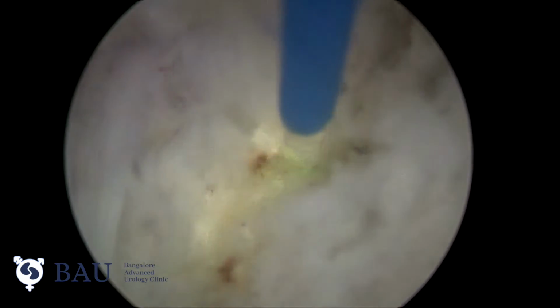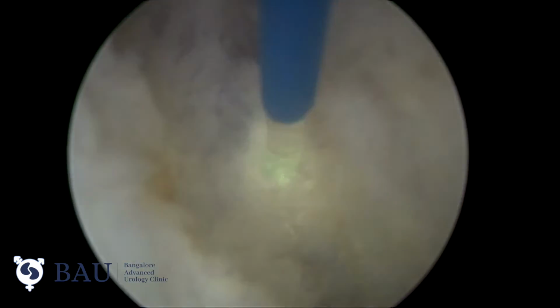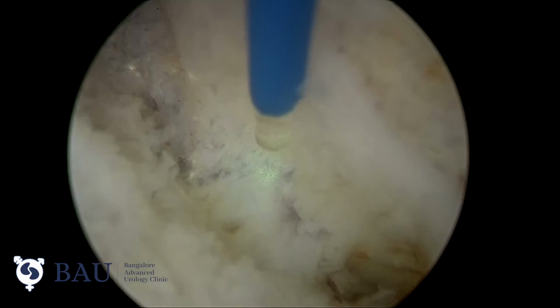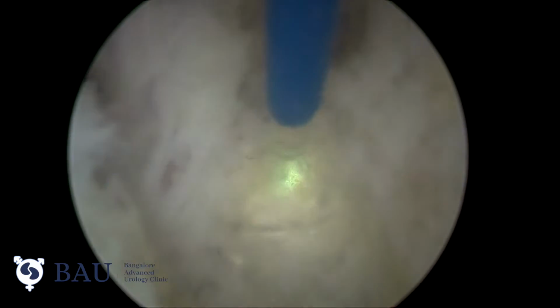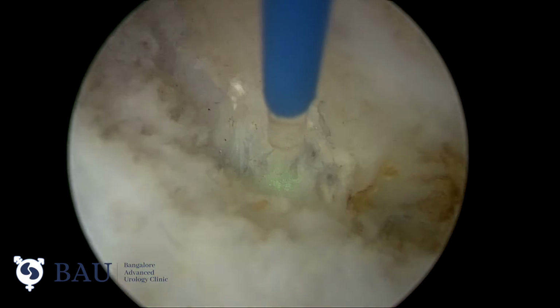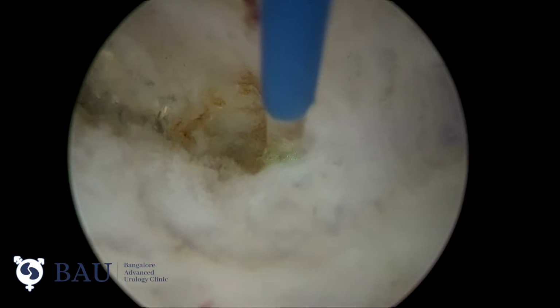In this patient, the capsule is very thin, so we have to be careful during dissection. Should never perforate the capsule and be close to the gland. You can clearly appreciate how the capsule is detaching, how the lobe is detaching from the capsule.